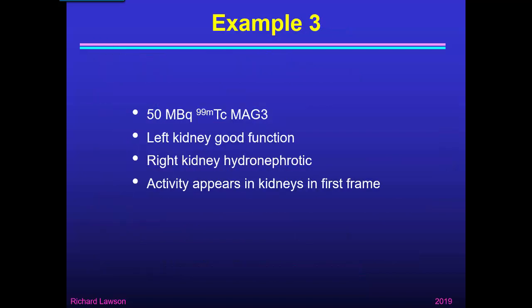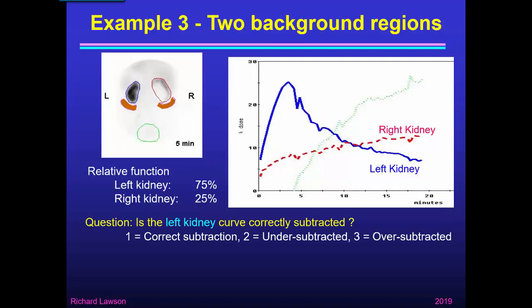That was a difficult example with DTPA and poor function. Here's another patient — this patient used 50 MBq of Technetium MAG3. The left kidney has good function; the right kidney is hydronephrotic. Once again, activity appears in the kidneys in the first frame, so we don't need to worry about any delay. At the 5-minute image, you can see good function in the left kidney, and the right kidney is hydronephrotic — just a little outer rim of parenchyma and a big dilated pelvis in the middle.